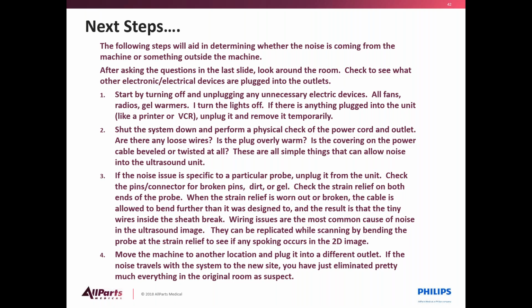And then the last thing, if you're able to do this, is move the machine to another room, another location, and plug it into a completely different outlet. If the noise travels with the system to the new site, then you've just eliminated pretty much everything in the original room as suspect. If it does not travel with the machine, then you know you've got something external to the machine that's causing your noise.